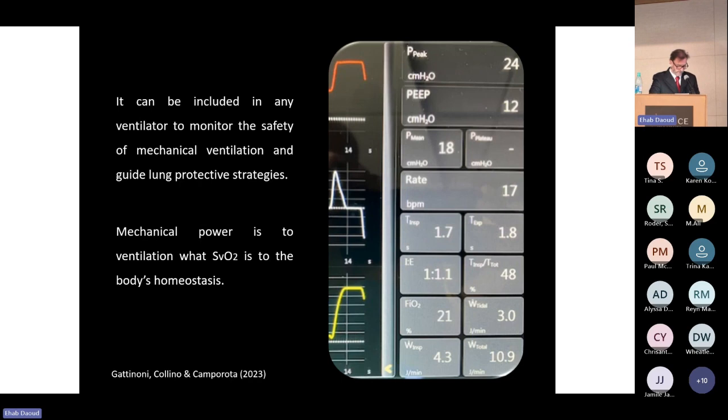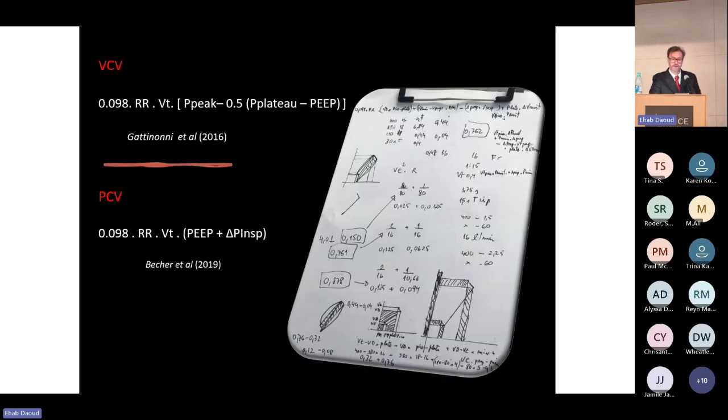Remember that formulas are different for each ventilation mode.